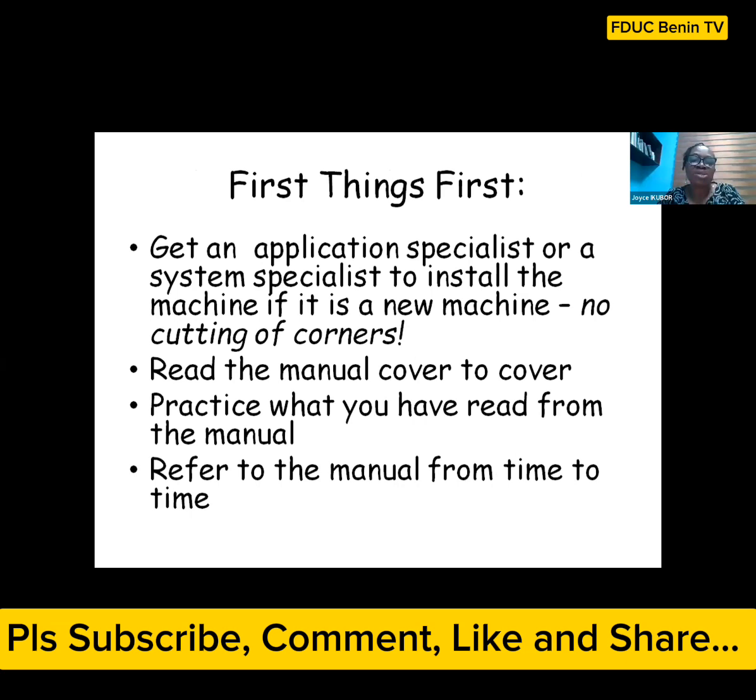Now, first things first, according to Stephen Covey. If you're going to use an ultrasound system, you need to get an application specialist or a system specialist, someone who will help you to install the machine, especially if it's a new machine. You just have to do that.